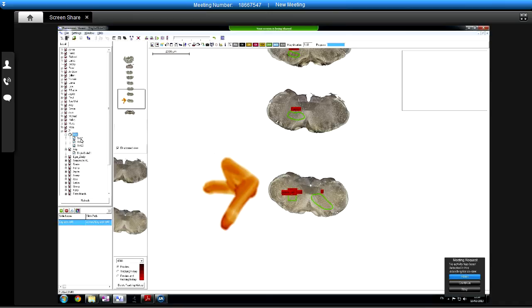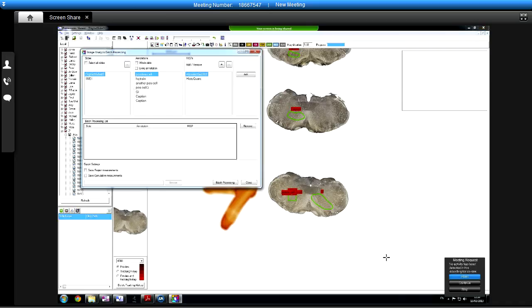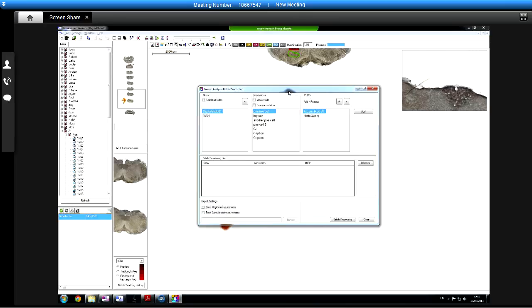If you click on a folder and then click plus, it will add all the ones in the folder. And if you click on the little image analysis icon here, what that will do is that brings it up. So you've got each of the slides here that I've selected. So there's only 2. I can select all if you like, or I can delete one. What we do is you're creating like a job list here. So this is the first one. You can do the whole slide. You can do every annotation, or you can select them, or you can go on that one.